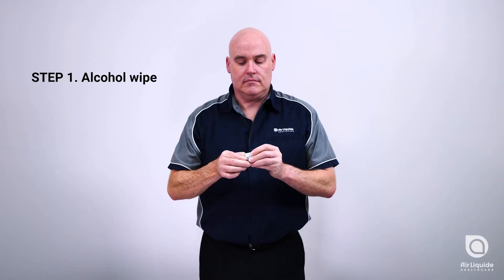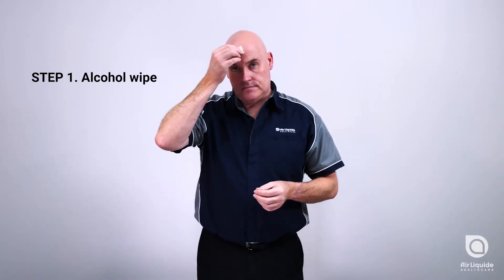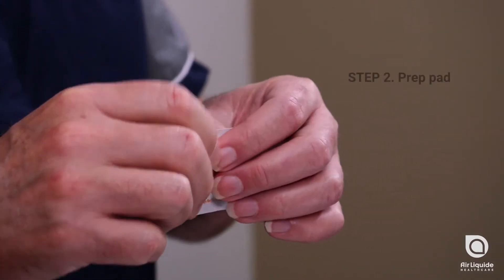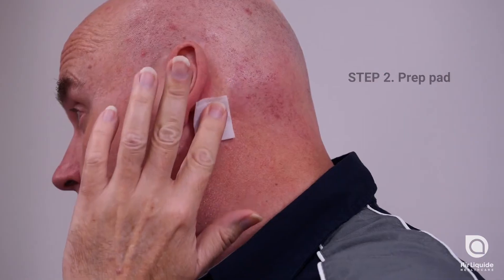Step 1: Open the first alcohol wipe. Use this wipe to clean each individual site as displayed in the manual. Step 2: Open the prep pad and exfoliate each of the sites.